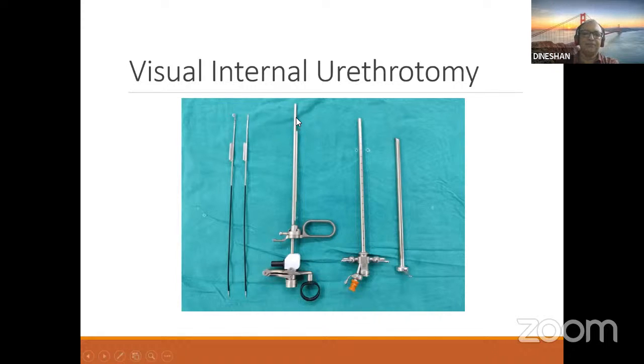This semilunar, the half moon shape knife, is used for bladder neck incision. The advantage is that you can cut the neck through forward and backward movements, even while introducing it.